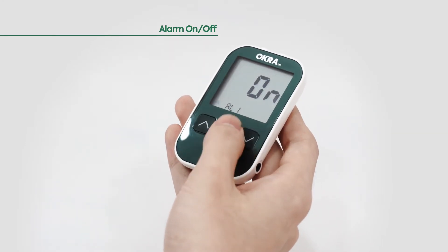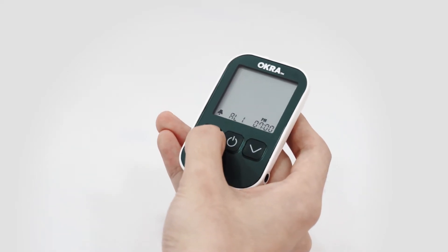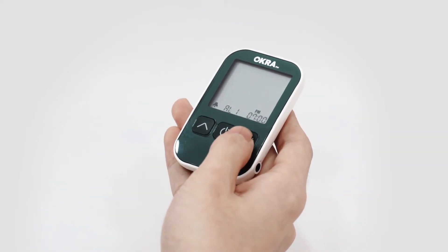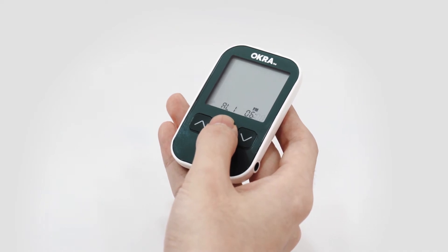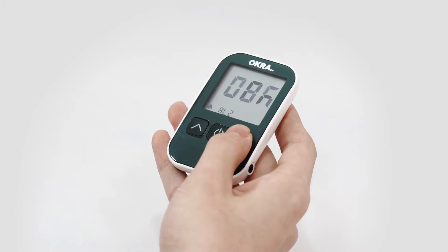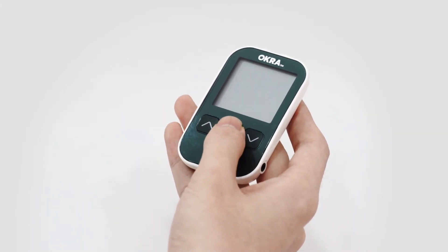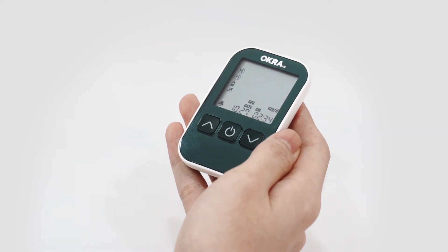Next, set up the time of your alarm with the up and down buttons. Five alarms are available. Press the power button to exit.